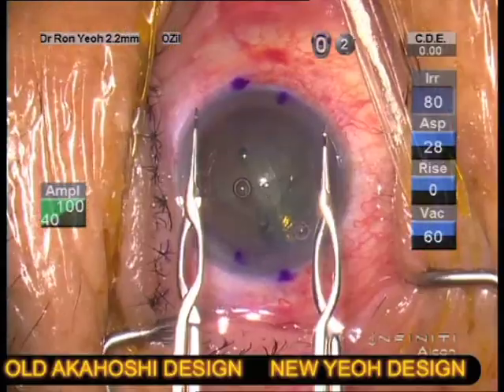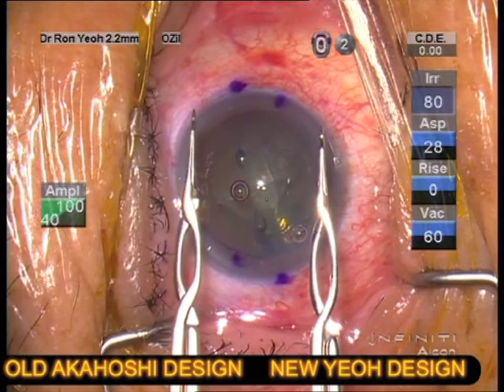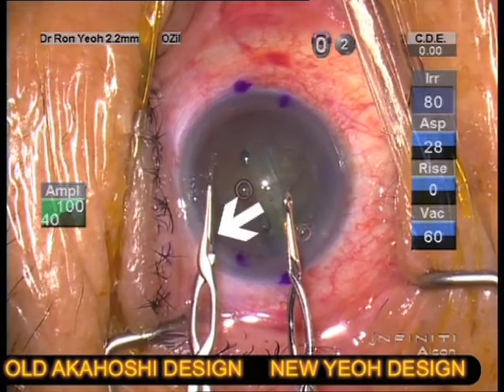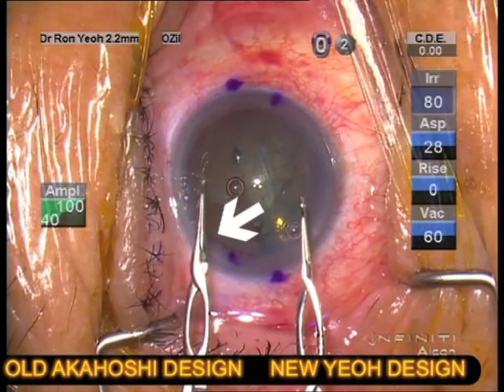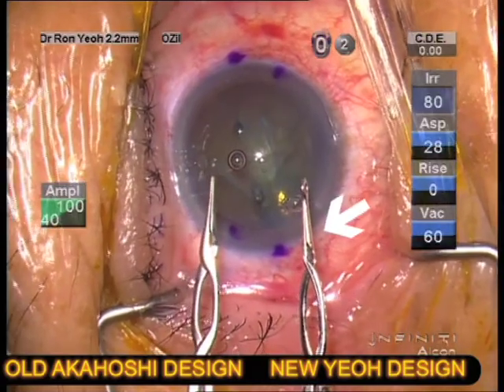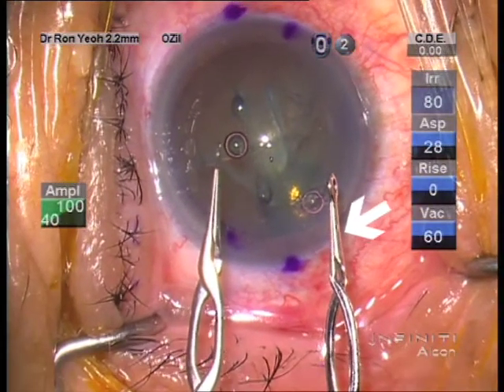The use of a pre-chopper to complete femtonuclear fragmentation is logical. The original ring pre-chopper of Akahoshi is shown on the left, and the modification I made to debulk the crossover point is on the right.